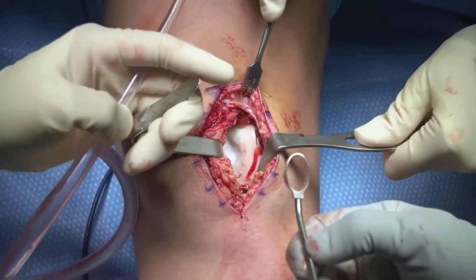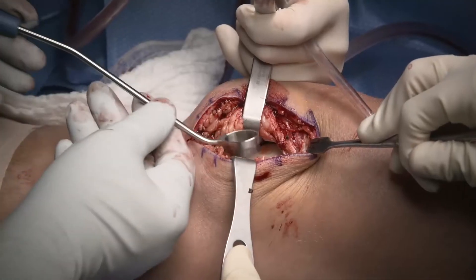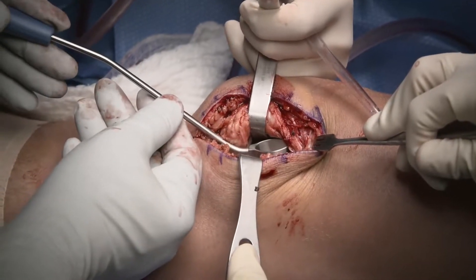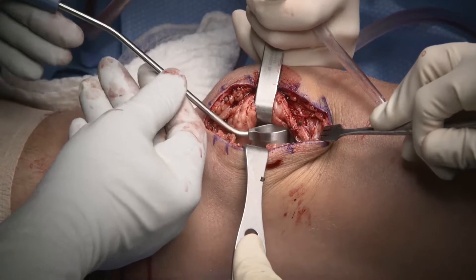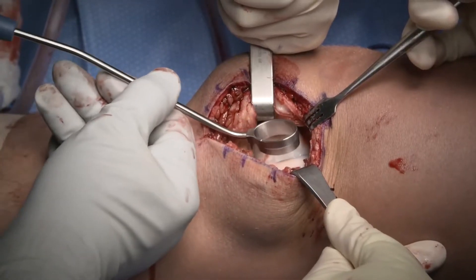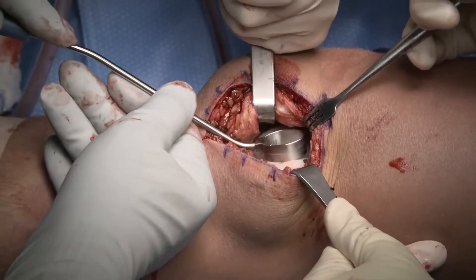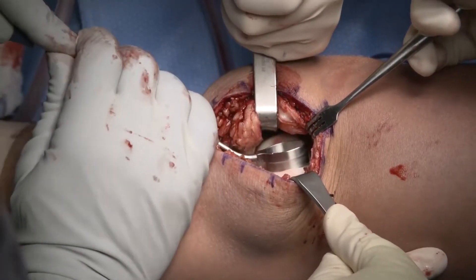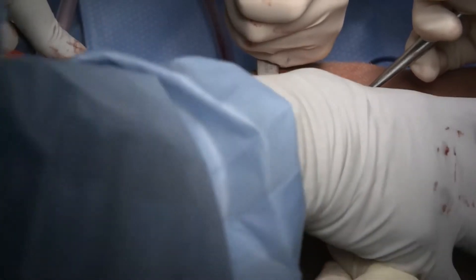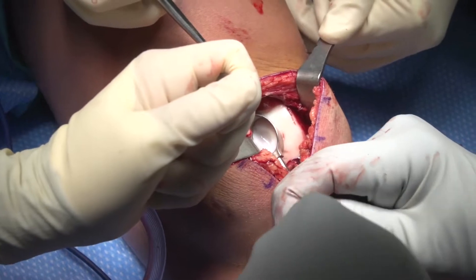We have a series of custom cutters that are essentially oval or round in shape. In this case, we're choosing the oval one and will basically use the smallest one necessary — the 2.7. Now that we have custom cutting guides shaped to the various types of defects, the debridement and defect preparation has become much easier. We used an oval cutting guide to initiate the debridement that was able to extricate all the damaged cartilage.